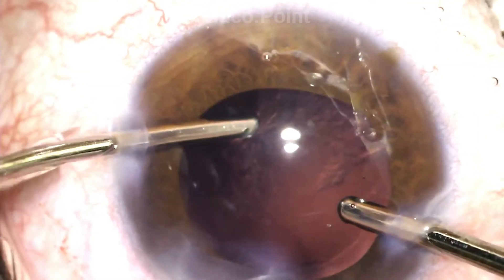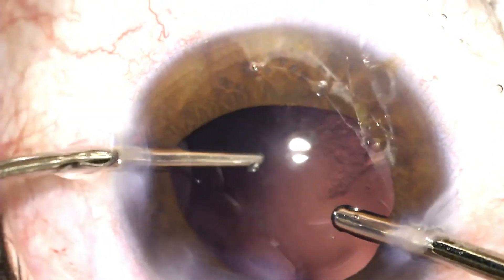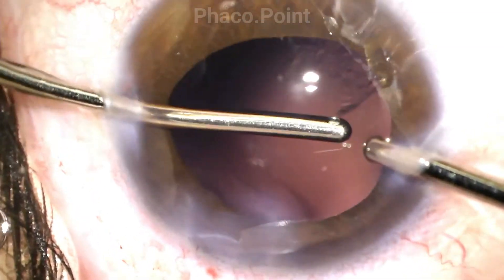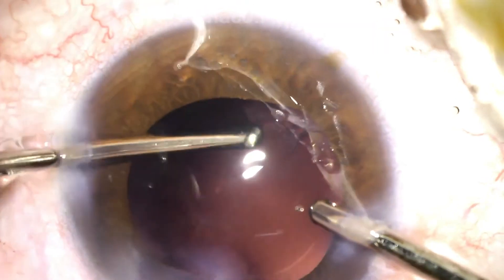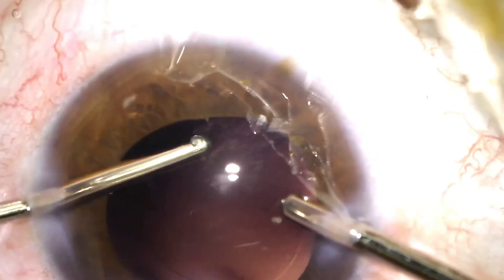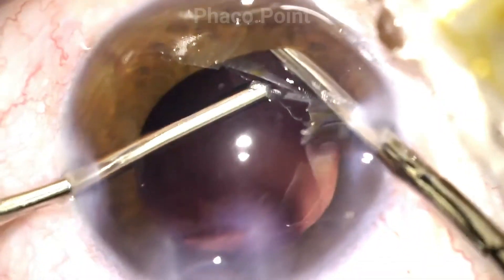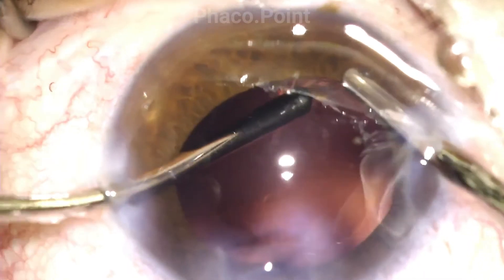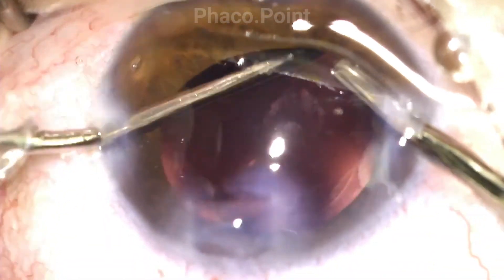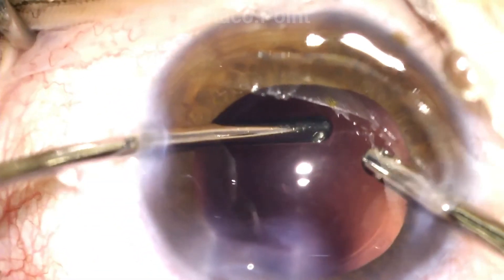The removal of the posterior capsular cells is facilitated with the aspiration cannula. Note how the aspiration cannula merely goes and rubs against the posterior capsular cells. The aspiration port never faces posteriorly — it's always facing anteriorly and is in the line of sight of the surgeon. The mere mechanical rubbing of the tip of the aspiration cannula onto these cells loosens them, and the aspiration is adequate to aspirate these loosened cells, resulting in an adequate posterior capsular polish.